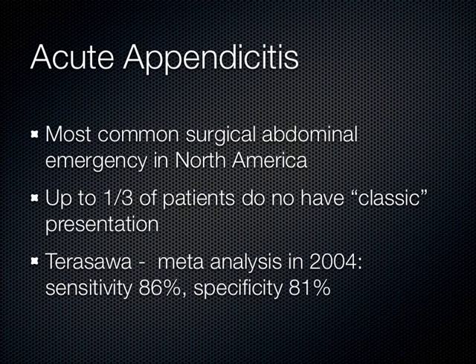And certainly when I have a kid in my ER, 10, 12, 14 years old, I really try to avoid getting a CAT scan on them, though sometimes I have to get it because the benefit outweighs the risk. Now, if we could get good with ultrasound, and see a true appendicitis on ultrasound, we could avoid the need for a CT scan, especially in a younger patient. The average age of somebody who gets appendicitis is 27 years old.